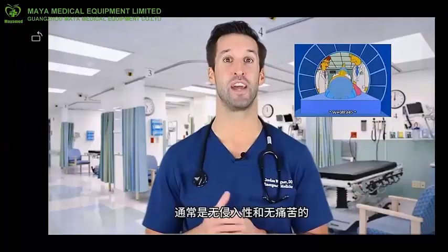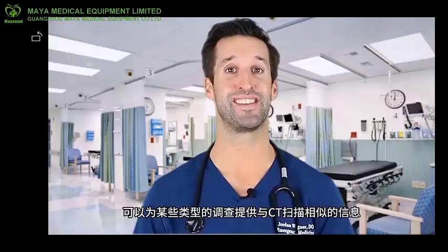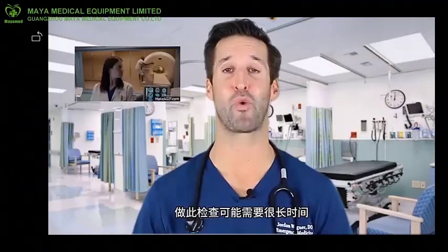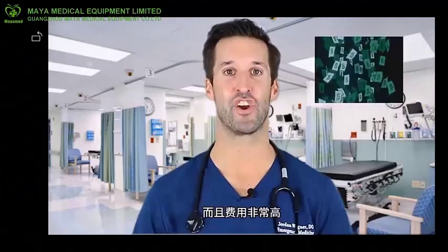Advantages: it's usually non-invasive and painless, uses no ionizing radiation, and can provide very similar information that the CT scan can give you for certain types of investigations. Disadvantages: it can take a lot of time and be quite noisy to get this done. Any slight movement will distort the image and will have to be retested, and it's very costly.